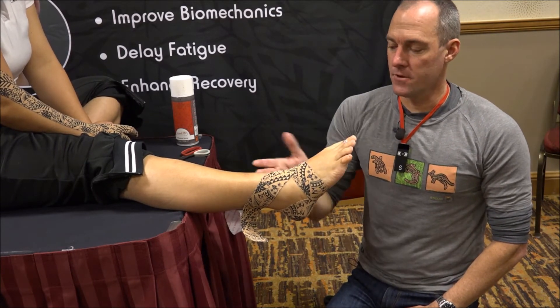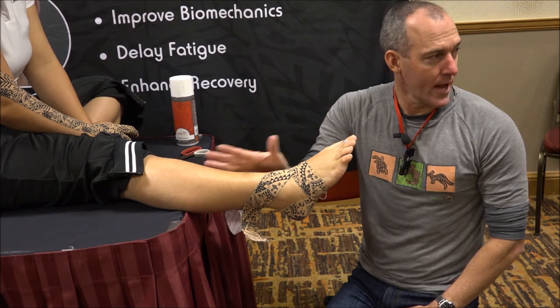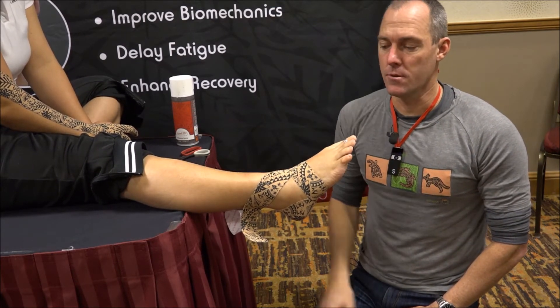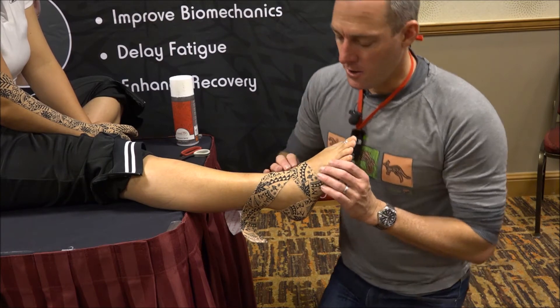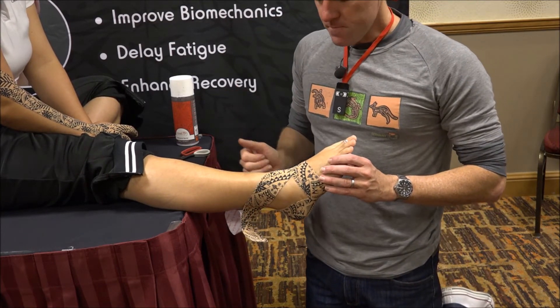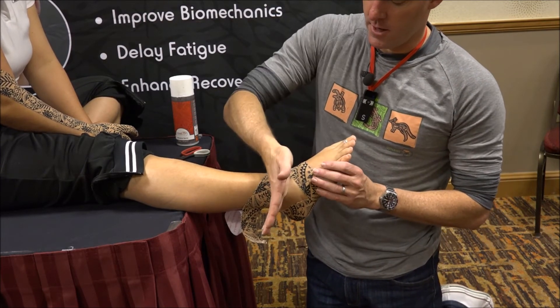This tape actually feels really nice up the shin bone — I've had stress fractures in both of my shins. Several people have told me that without being cued, they've just said it feels really nice on the bone. Whether that's a bit of that boxing-up effect or whatever, I'm not sure, but it does feel very nice. So you can just come up and lock off over onto there, or just come up and lock over to here without doing that full circumferential one.